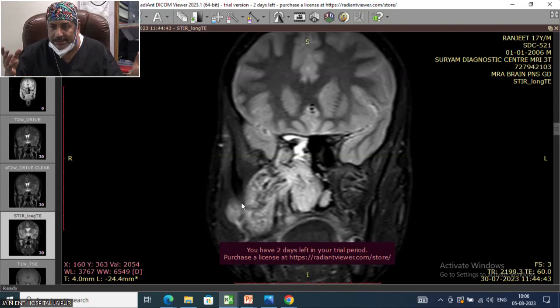In spite of being a 17-year-old, this looks too vascular. When you take out a bulk, this bulk contains a lot of blood, so you need some replacement. That's another logic about that. So this is all vessels only. This is all a bunch of vessels only.